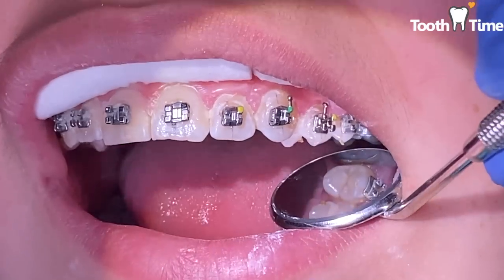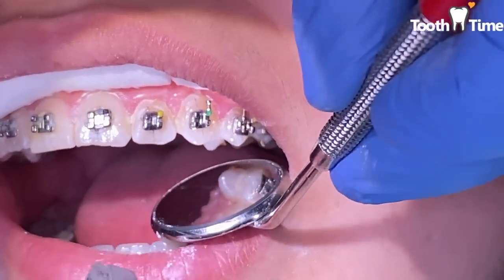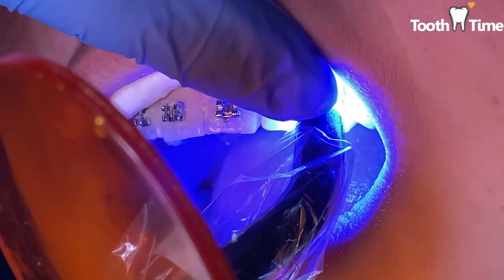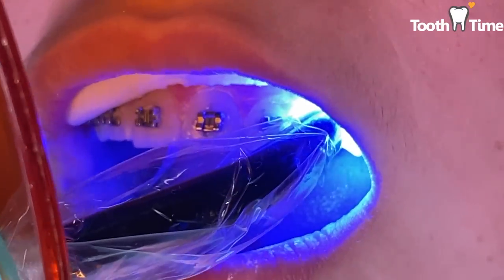After we place the bracket, we measure it, then cure it to make sure it stays on really well. What is a curing light? It's a UV light that is super bright — don't look into it. You need to protect your eyes because it will hurt them. It goes ahead and hardens the glue. That's pretty much what it does — it just hardens the glue.